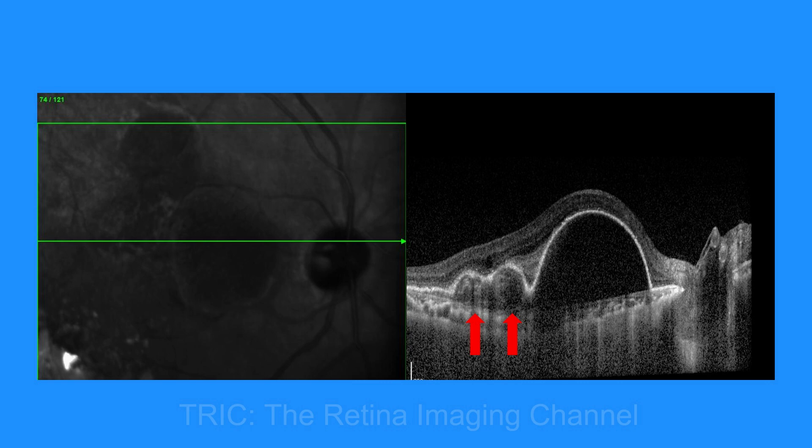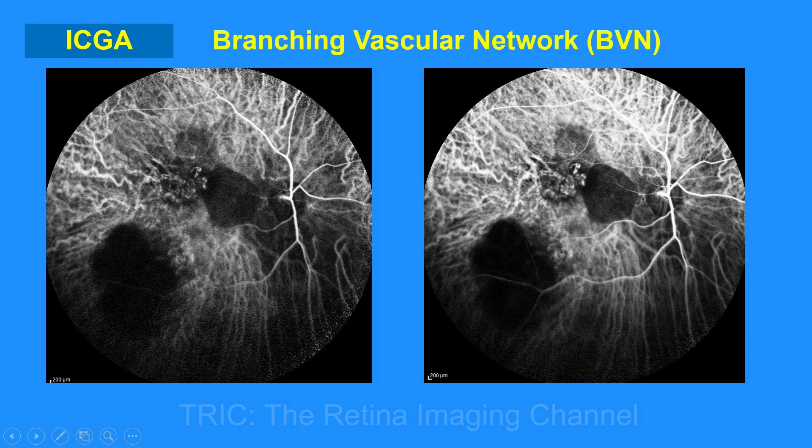When we did an ICG of this patient, we saw branching vascular networks in the areas of RPE undulations and thumb-like PEDs. The RPE undulations were caused by blood vessels which are part of the branching vascular network, as shown here.